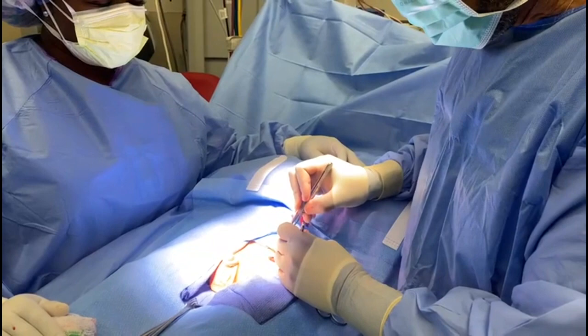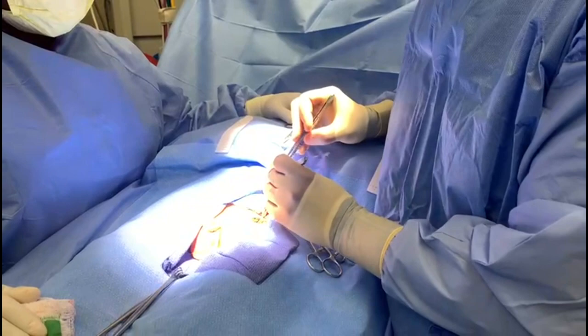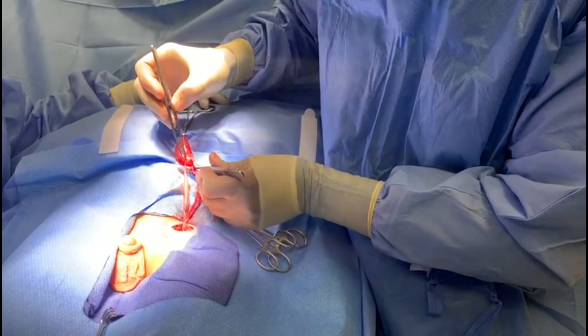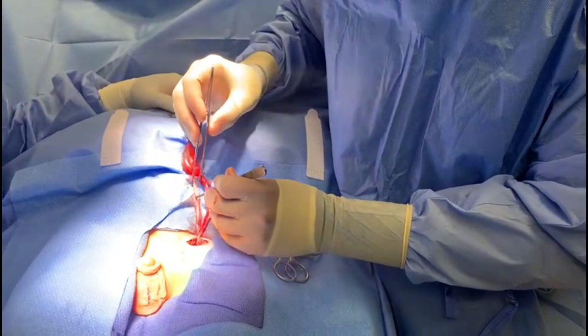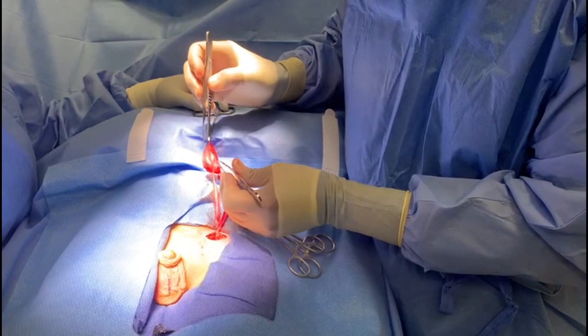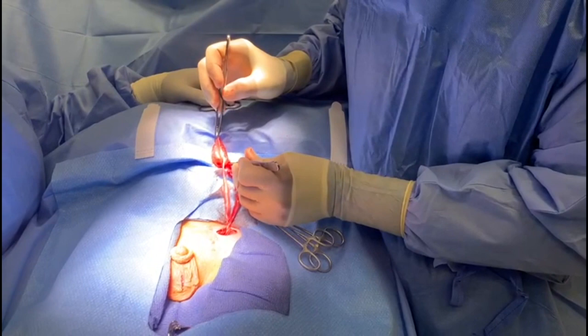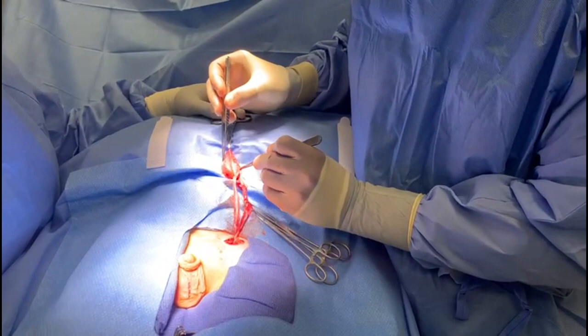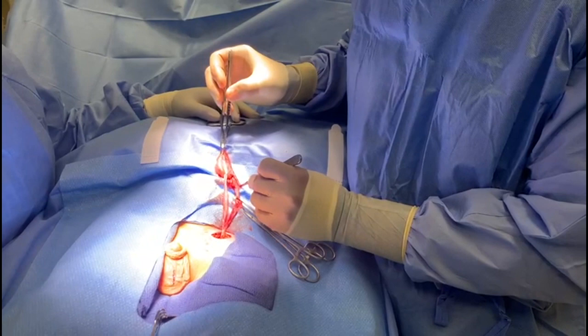We've dissected the cord structures, and now the hernia is isolated. I've isolated the small ostium here; cord structures including the vas deferens are here. The issue is the testicle is inside this space, so it seems like we have a hernia and a hydrocele at the same time. Usually in a child they're one and the same semantically, but in this case, the structure around the testicle is actually the tunica vaginalis — not necessarily the processus vaginalis. So we truly have both a hernia and a hydrocele in this particular child.